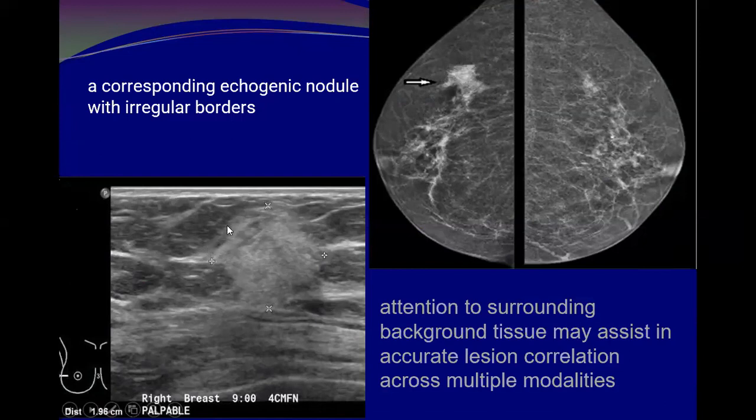So we have to consider this. Generally, when I look for lesions on mammography and at ultrasound, if I have seen it in a CC view, it will be much easier because it will tell me whether it is in the medial or the lateral breast. But if I have seen a lesion only on MLO and could not see it in the CC view, and MLO is usually taken with an angle that varies between 30 to 60, I will not be sure at which area I have to search.